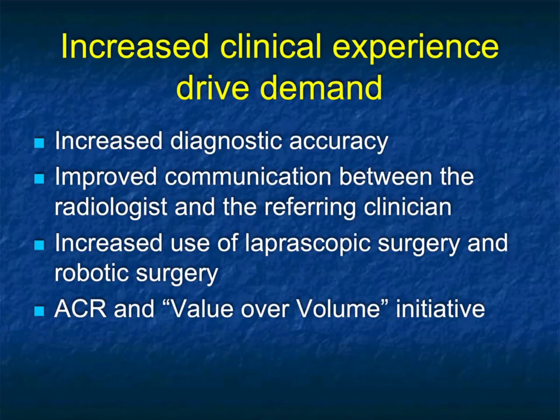Now, I mentioned that increased clinical experience drives demand, the need for increased diagnostic accuracy, the need for the ability to use imaging for preoperative planning. The improved communication between radiologists and referring physicians is one of the things that 3D provides. And with the increased use of laparoscopic surgery and robotic surgery, the field of view for the surgeon is a lot different than just opening the abdomen. So they need to know a lot more in advance. And so this will provide that.